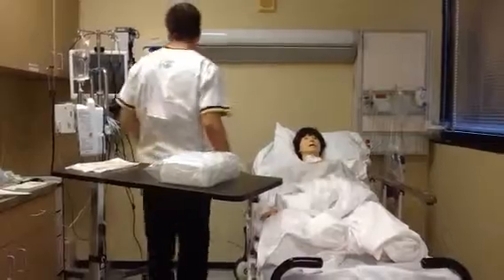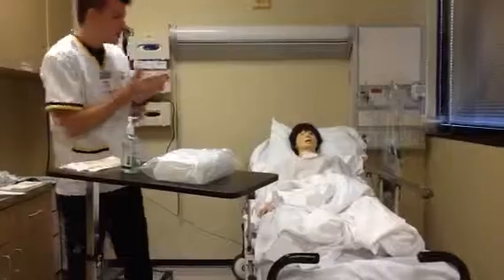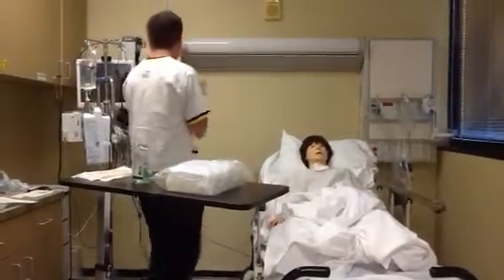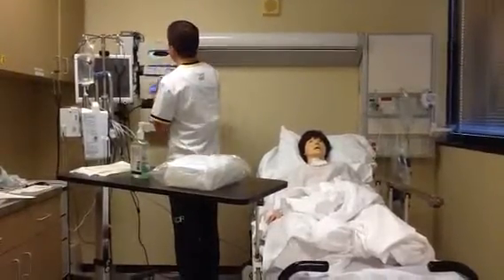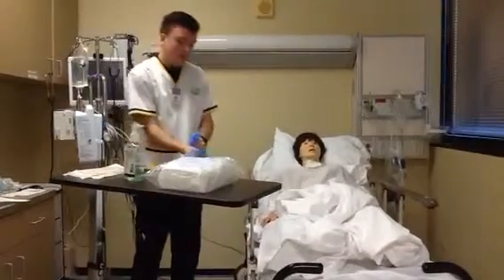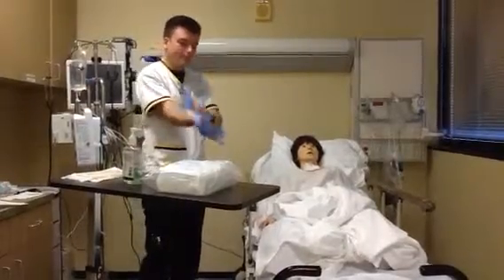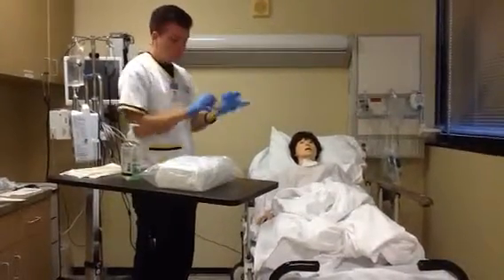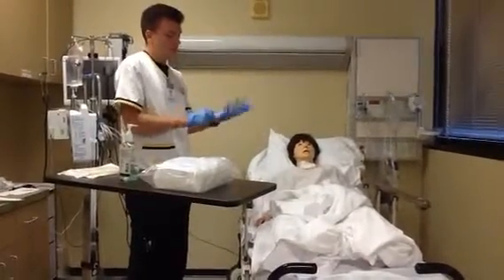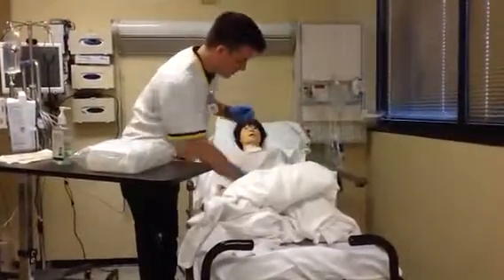Okay, I'm going to do a real quick assessment here. I'm going to first perform hand hygiene. Just want to assess the perineal area, make sure I don't need to do any care prior to the insertion of the catheter. I'm going to put on my non-sterile gloves. Alright, and I'm going to do a real quick assessment of the perineal area.